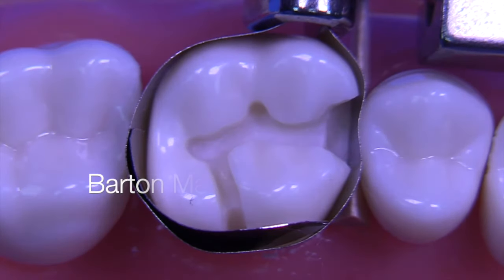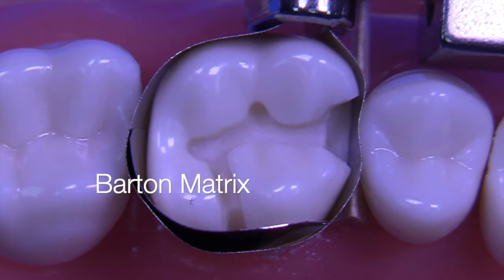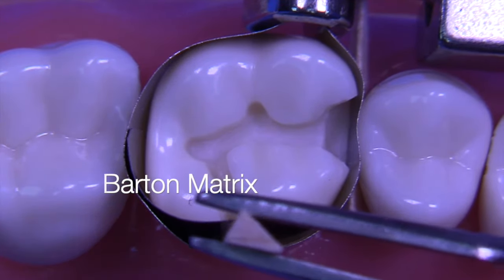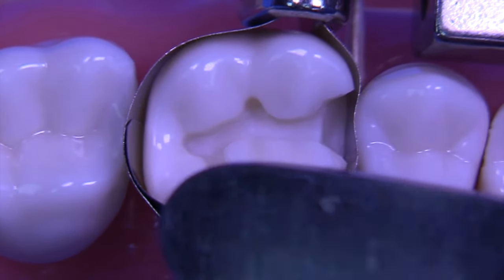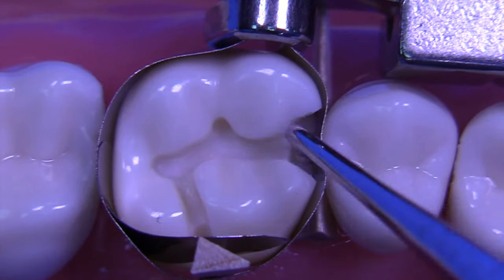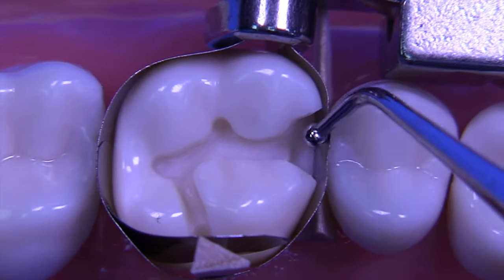We're then going to add the Barton matrix. The Barton matrix is a technique to provide a wall upon which to condense when you have lingual extensions. This technique was developed by Dr. Barton many years ago, I believe at the University of North Carolina. We insert a wedge, which can be secured with compound or just a little bit of pressure, and then we're going to use that to condense against. We'll burnish the band with a ball burnisher and make sure we have adequate contact with the adjacent tooth.